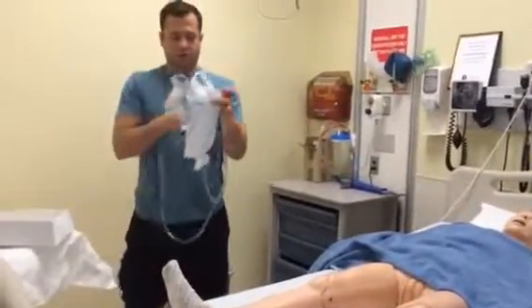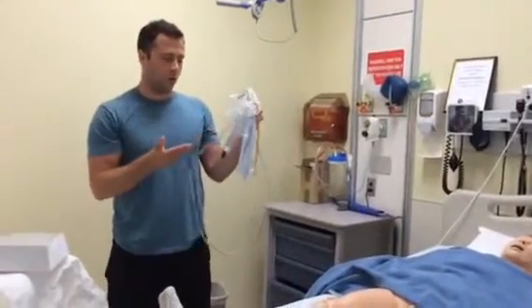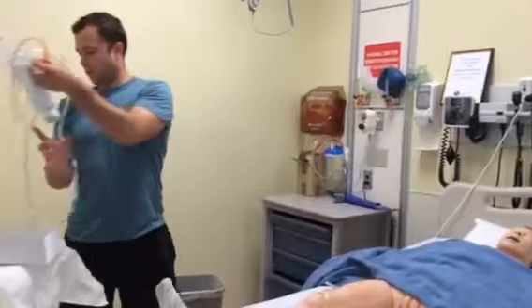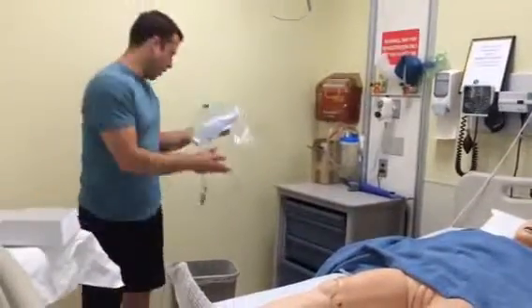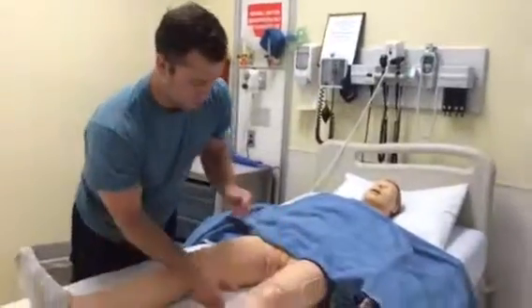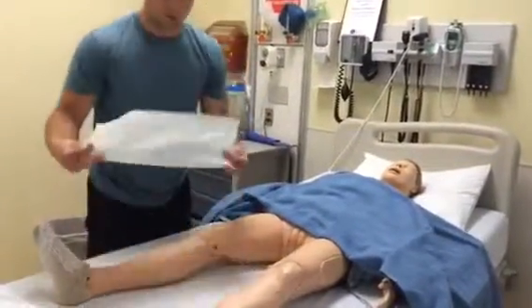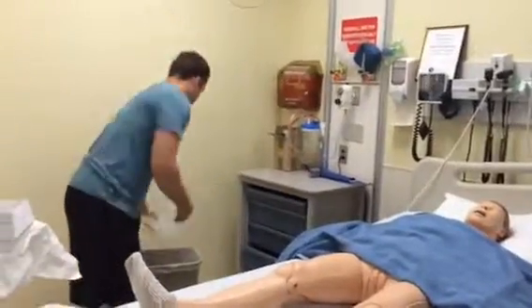And I would remove this. I'd be able to empty this into a bag if the doctors wanted a sample, as well as record the amount if we needed it. And I would throw this away. Take out this towel. Throw that away.